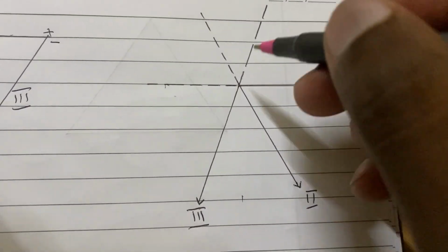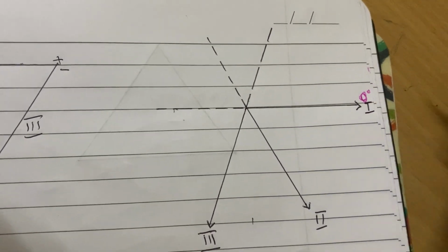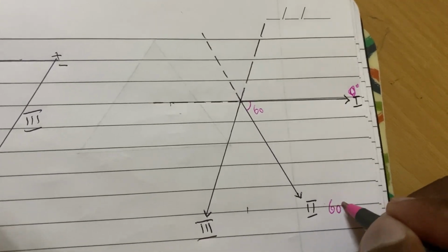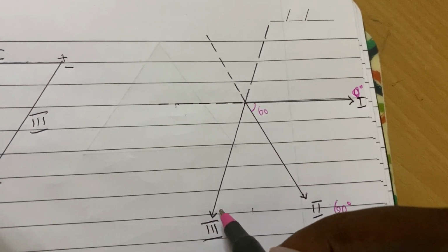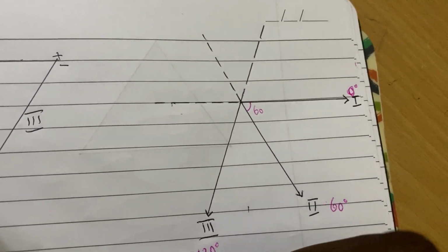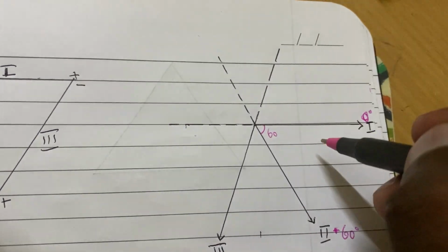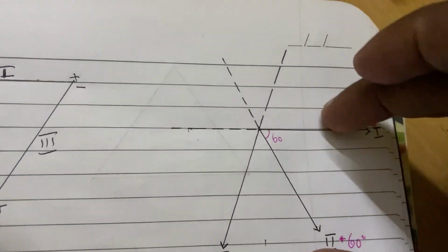What we said is that this lead 1 is 0 degrees. Anything going up is negative, anything going down is positive. So from here to here we have a 60-degree angle. So lead 2 is at 60 degrees. And then lead 3, 90 is here, so 90 plus 30 is going to be 120. So lead 3 is at 120 degrees. These are positives. So here we have 180, and then going the other side, the other semicircle up, it is negative. So what was remaining is to put the augmented limb leads.